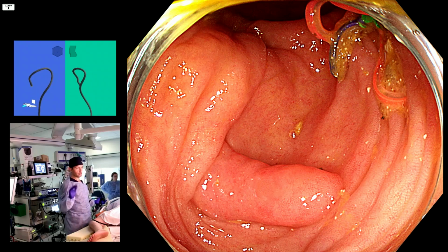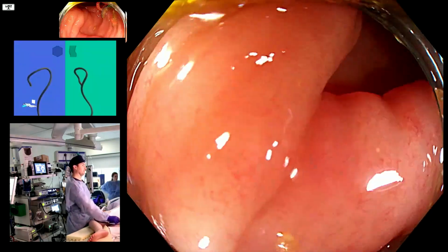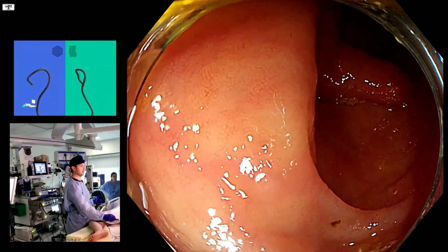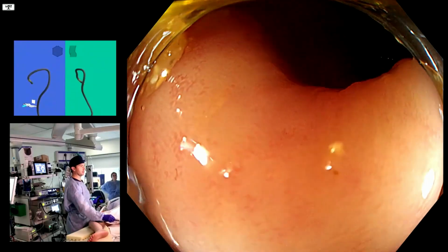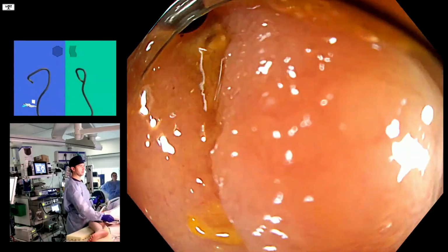So move your patient to get a good view of the base of the caecum, and remember to look underneath the ileocecal valve. And how do you do that? Well, you just pull the endoscope back with a distal attachment on in the orientation of the ileocecal valve. And as you come back in this orientation, we'll at a certain point see the ileocecal valve. There we go, into it there. And also we saw everything past it.